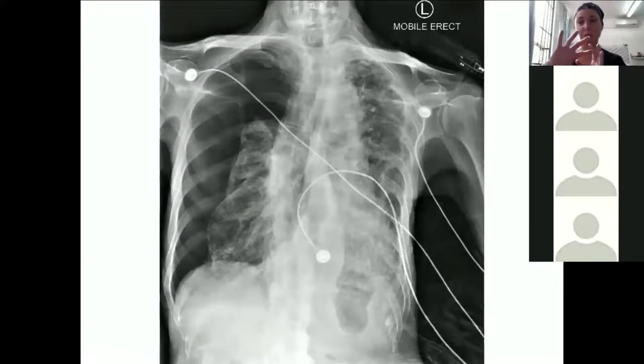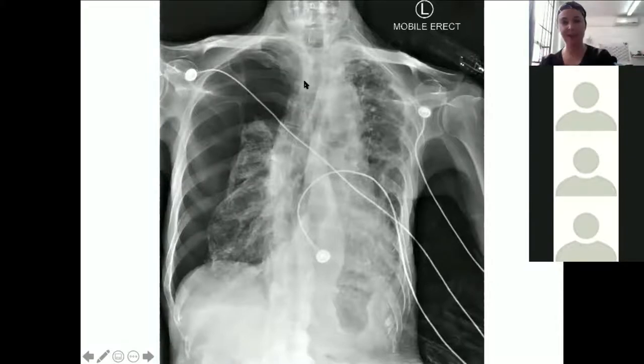Here your trachea is moved towards the left-hand side. On the right-hand side, you can see that you've got your lung that's completely collapsed down, and here's your lung. I'm showing you with my mouse and outlining where the lung is. Can you see between the lung and the chest wall cavity, this whole area here? You've got an area of really hypoechoic, basically a blackened area, and you've got no lung markings in that area. So this area here is your pneumothorax. Because you've got air trapped inside your chest cavity, pushing the right lung down, and then pushing your trachea over towards the left. You've got an example here of the trachea deviating towards the left, and it's being pushed by that free air.